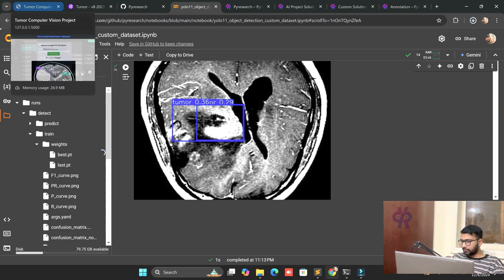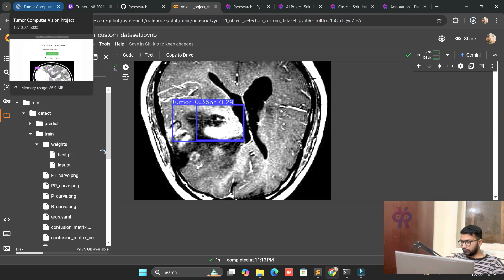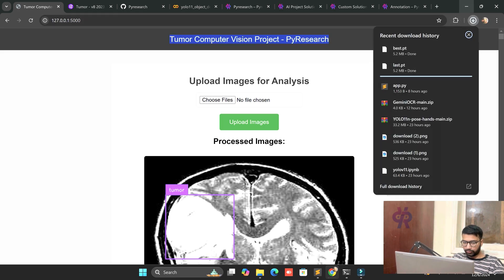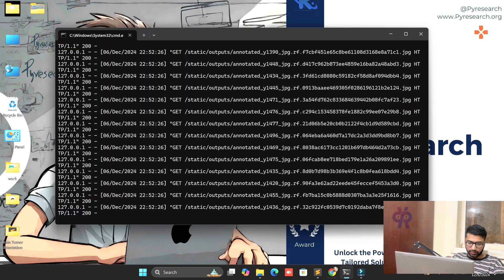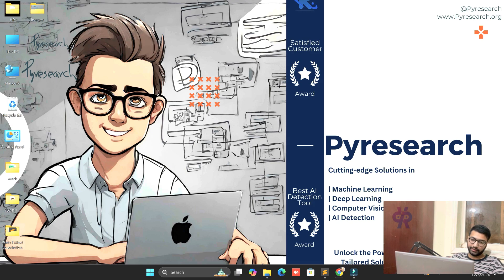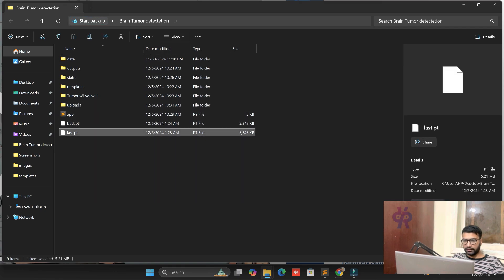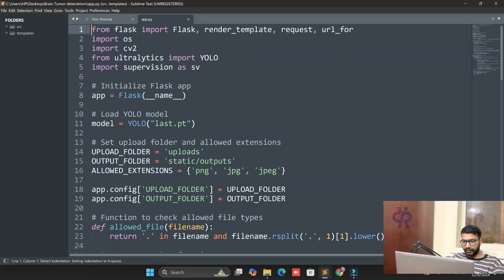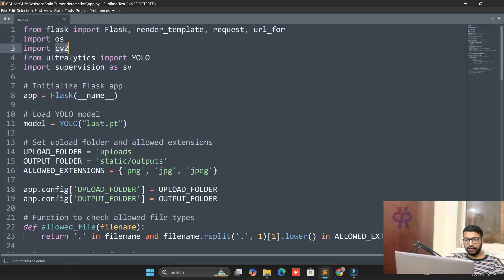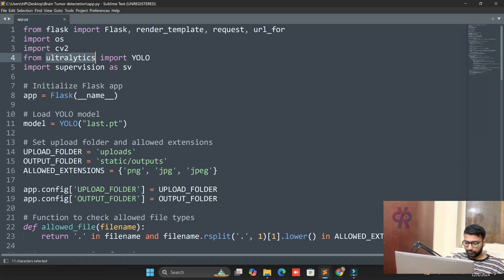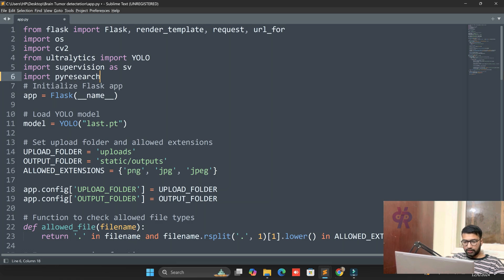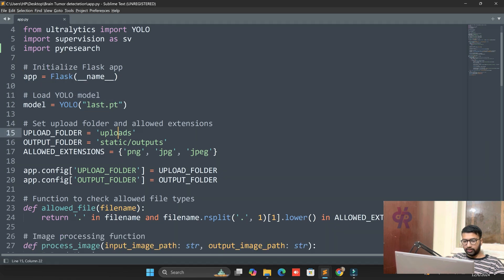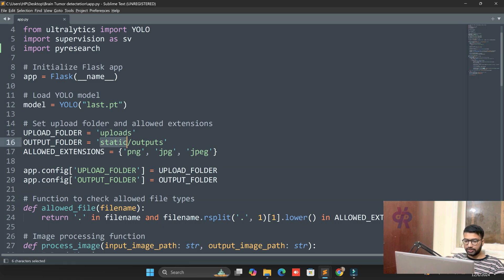After uploading to our same folder, we close all points and now go to our folder, this code folder: brain tumor detection. You put here both models, and now I am opening the script. The script works just like this: first of all, import libraries - OS operating system, CV2 means OpenCV computer vision, Ultralytics and supervision, and also we involve PyResearch. Save it here. Load the model. Now we have two folders: first, upload the images; second, the output.